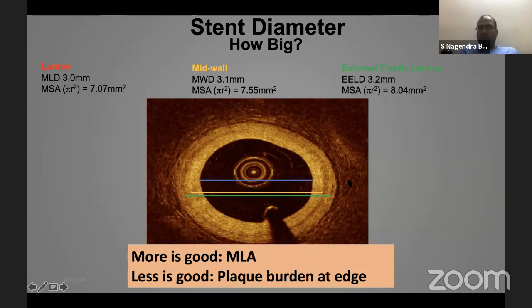Let's presume the mean lumen to lumen diameter here is 3.3. I can definitely take a 3.5 millimeter stent and utilize it. If the EM to EM diameter is going to be 3.76, then I will take a 3.75 stent, which is not available here, or I will take a 3.5 stent. I will not take a 4.0 stent. That is the point I would like to emphasize here. If you are going with EM to EM, you undersize it by 0.25.